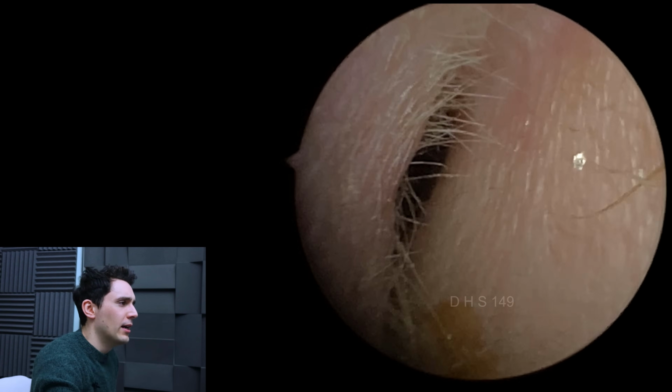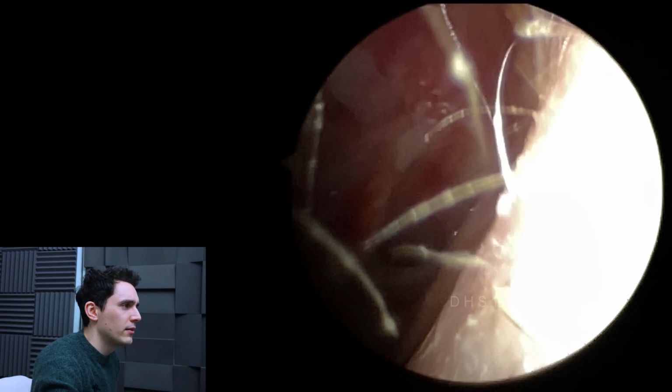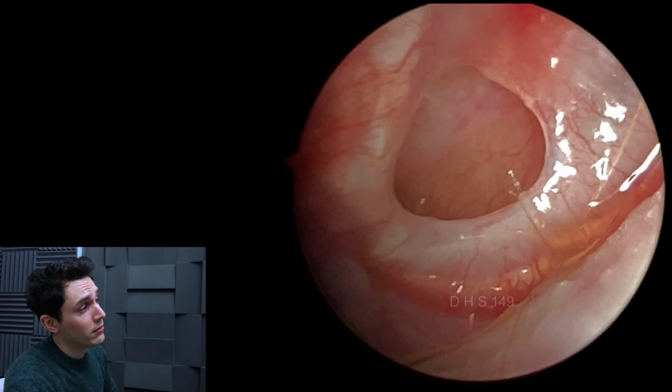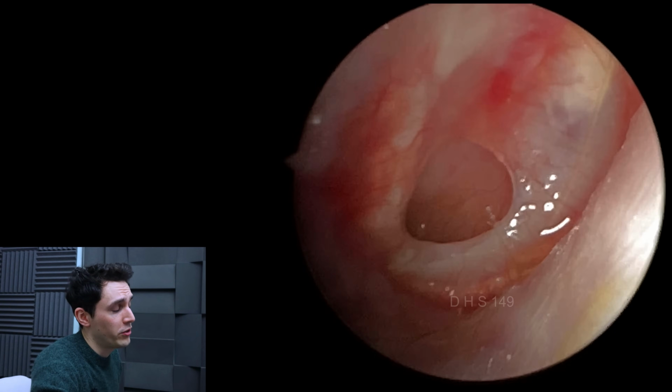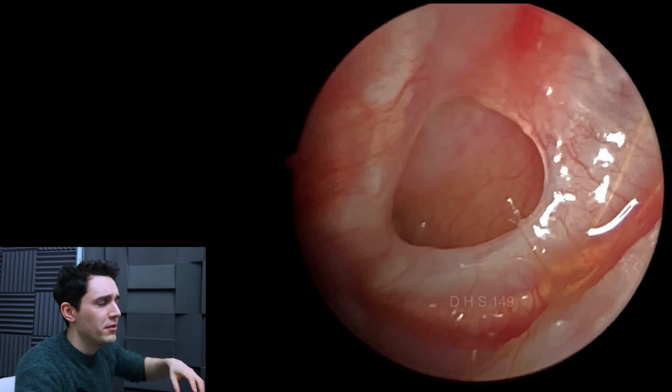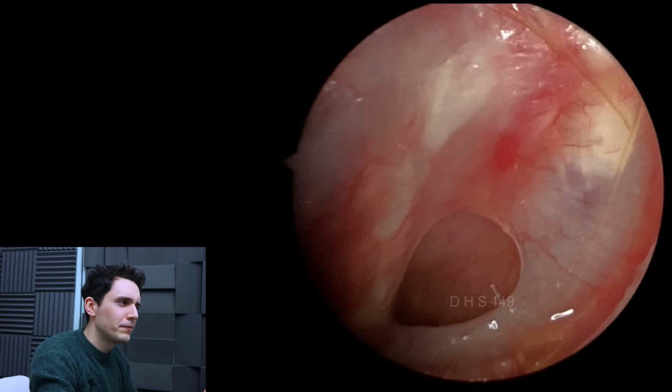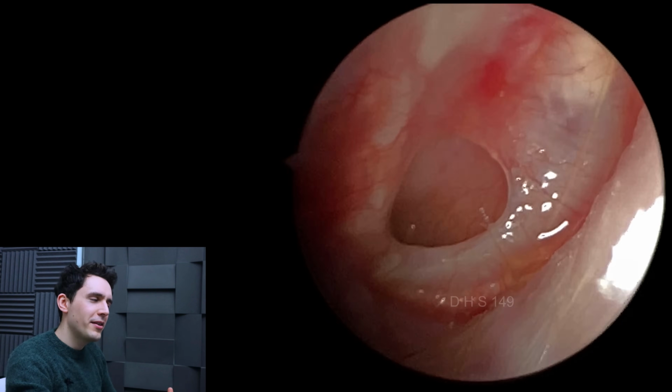So there we go. We'll go back in, have a quick look, and again, this patient will need medication from the GP, general practitioner doctor. In terms of the medication that he would be given, I'm hearing different things from different doctors.